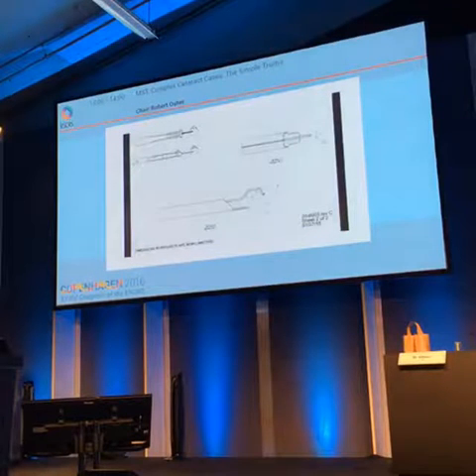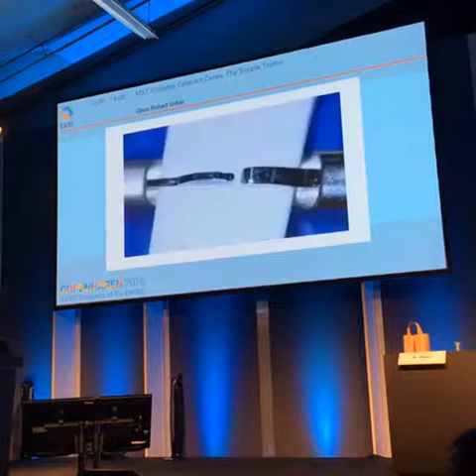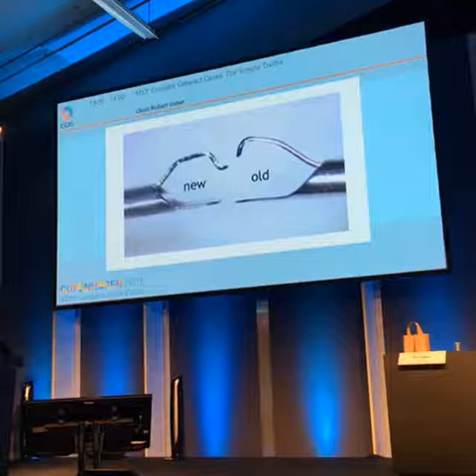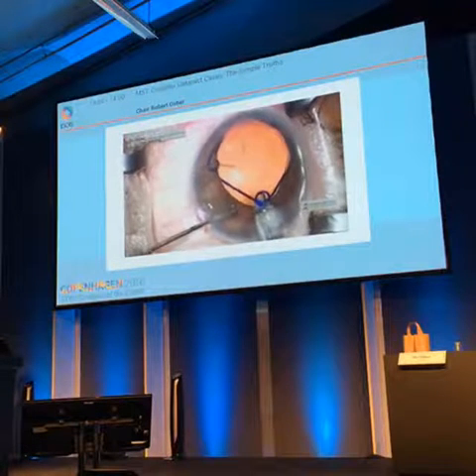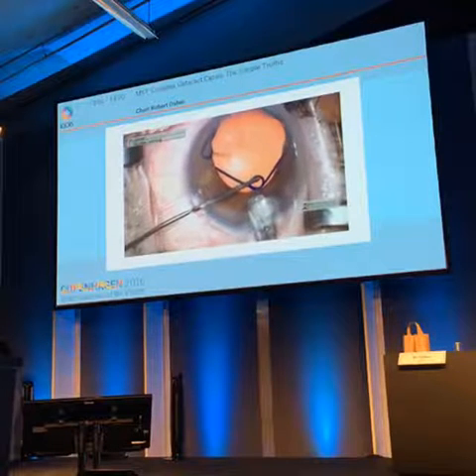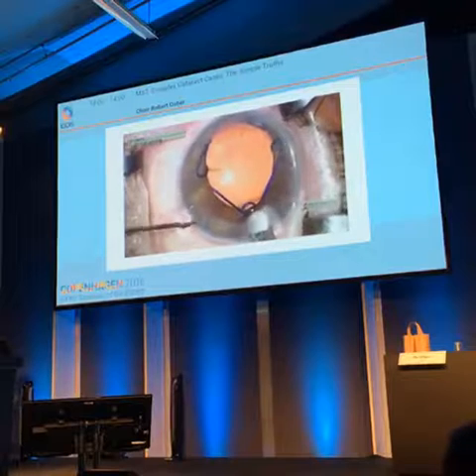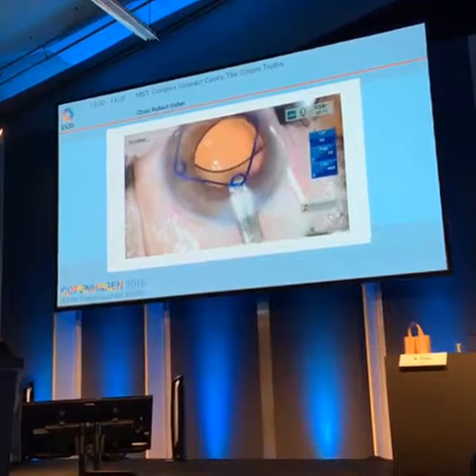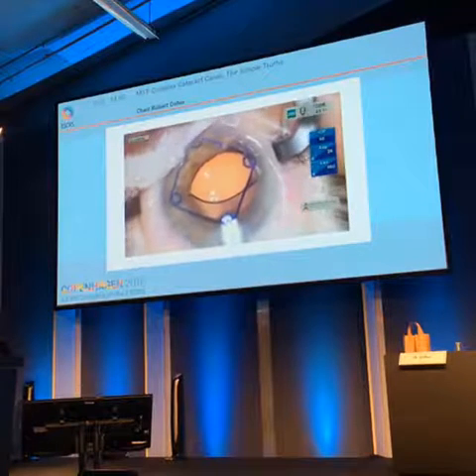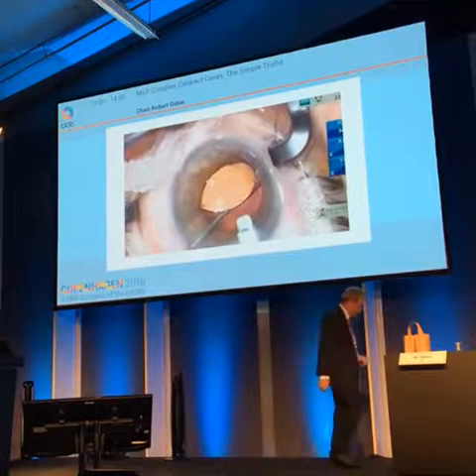I began a 2-year endurance contest to redesign the injector, thinning the finger and reshaping it so that the scroll could be easily released during the insertion. Then the scroll is transferred to the manipulator for a precisely controlled placement. When removing the ring, the tiny finger engages the proximal scroll, and the manipulator ushers the lateral scrolls into the injector.